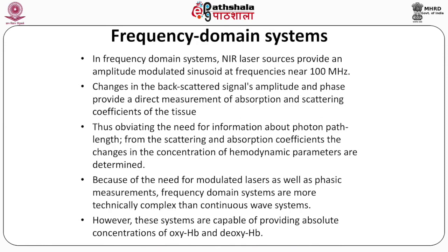In frequency domain systems, near infrared laser sources provide an amplitude modulated sinusoid at a frequency near 100 MHz. Changes in the backscattered signal's amplitude and phase provide a direct measurement of the absorption and scattering coefficients of the tissue, thus obviating the need for information about photon path length.